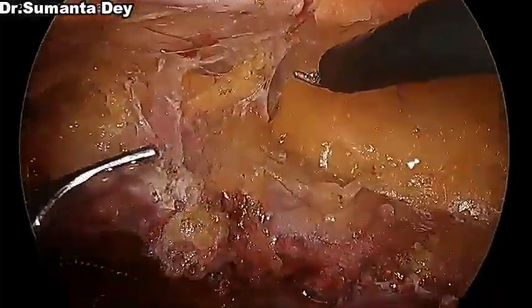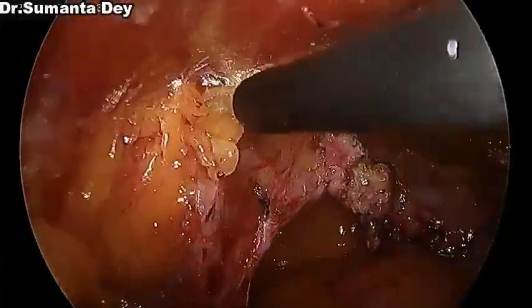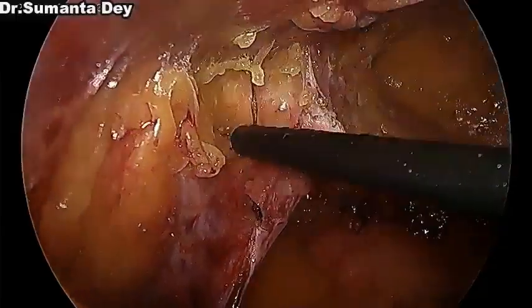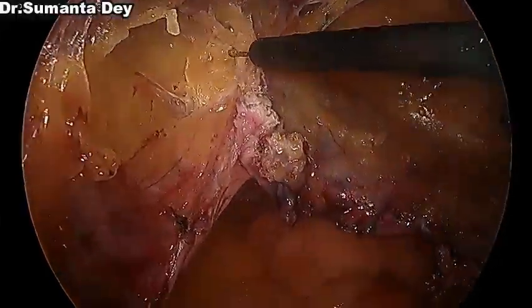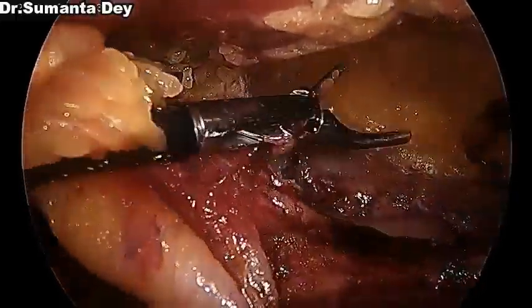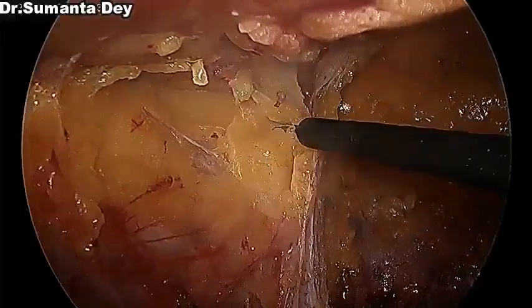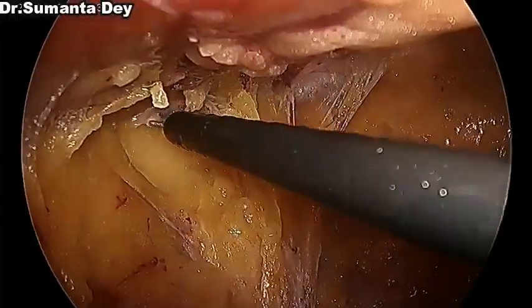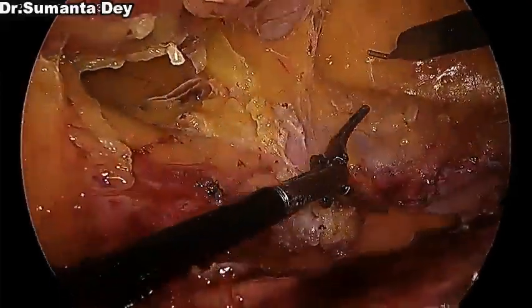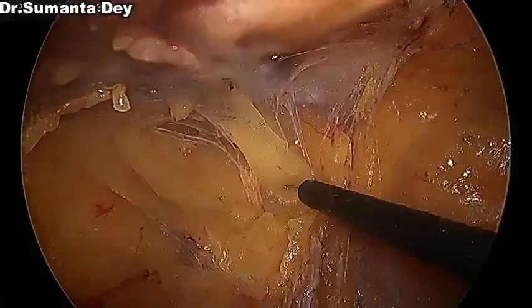So gradually I got all the peritoneum adjacent to the hernial defect into my flap, into the flap side, and now my target would be to mobilize the peritoneum beyond the hernial defect as much as possible, so that I can place an adequate size of mesh after closing the defect. And here I'm going towards the right groin area.